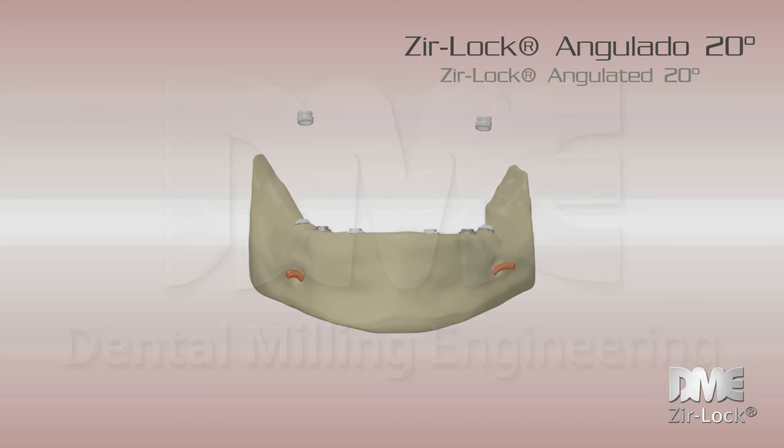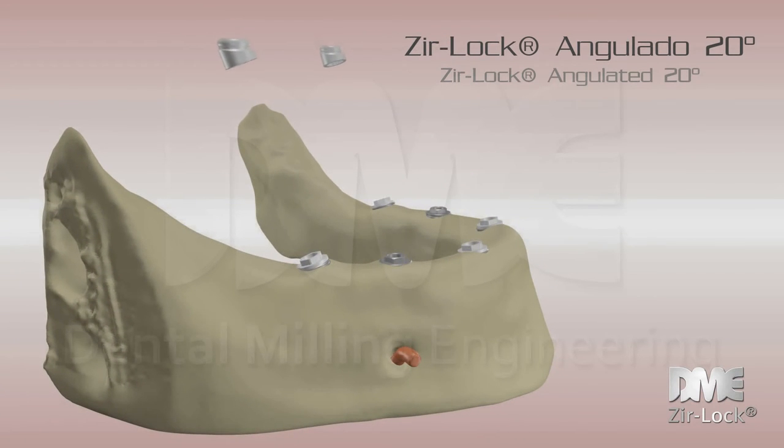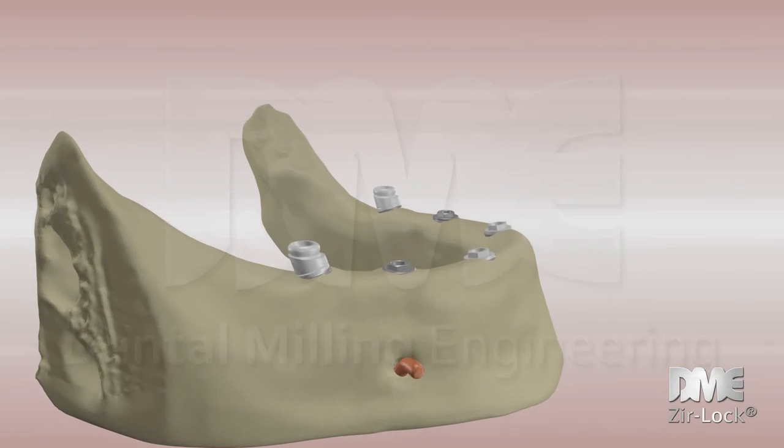It is advisable to subtract the Zir-Lock of the working model and transfer respecting the position that has been removed from the model.